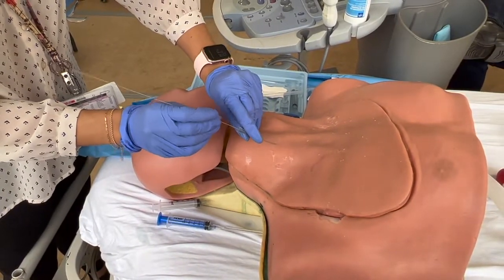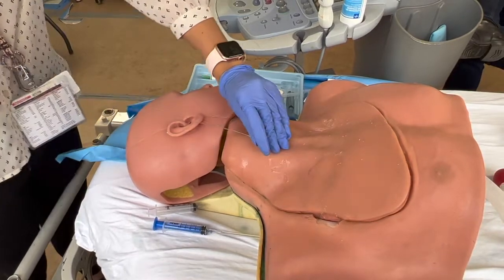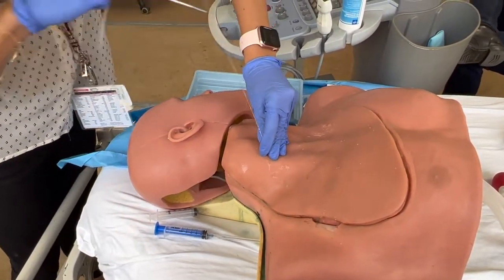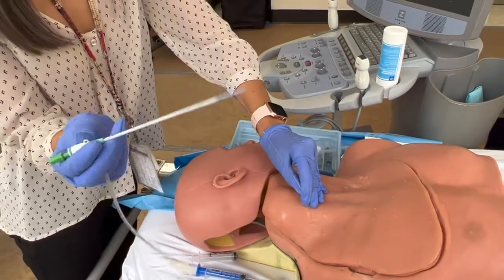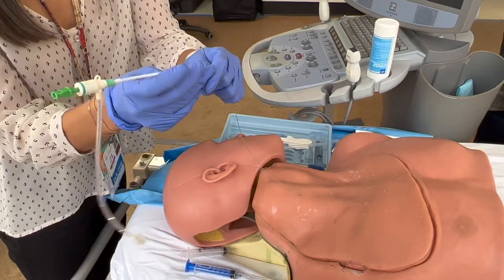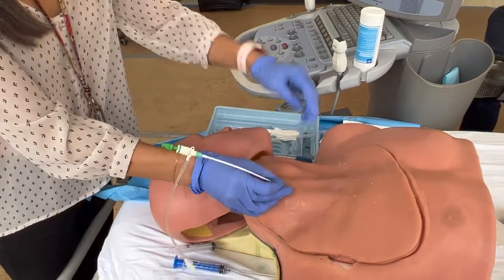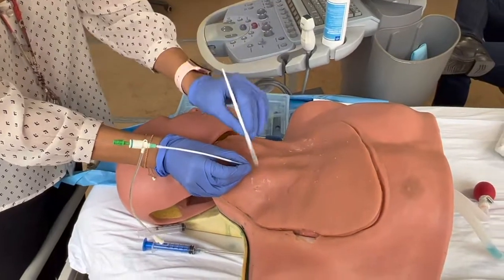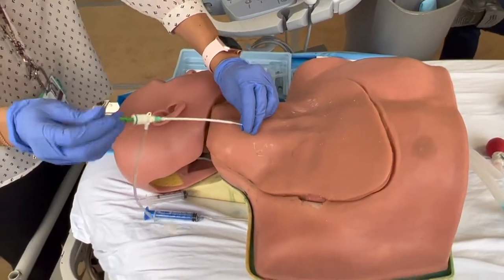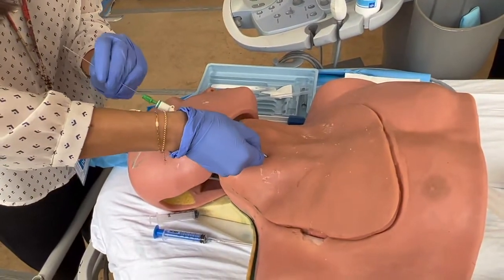Now you've got your wire in. You're going to remove your needle, keeping a hand on the wire at all times. Then you take your cordis with the dilator attached to it. I like to preload it before I cut. Theoretically you would then take your scalpel and make a nick, and then you shove the entire thing in there — keeping one hand on the wire and pushing from the base.